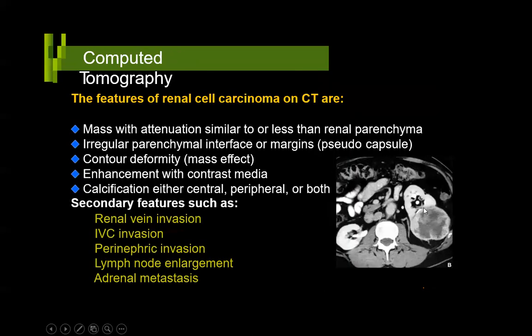Again, another example of renal cell carcinoma. You see, again, the central necrotic part is not enhancing as much as compared to the rest of the surrounding margins. So now the important thing is to know how to stage it.